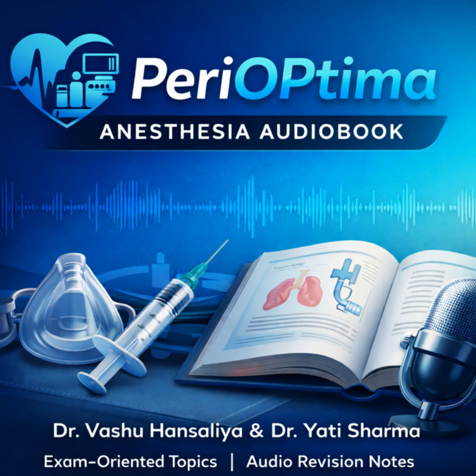If the patient stops breathing for any reason, too much sedation, a neurological event, the machine does nothing. It just waits. You would never, ever use pure PSV on a paralyzed or heavily sedated patient without a mandatory backup mode enabled.